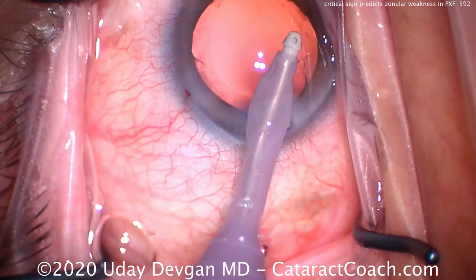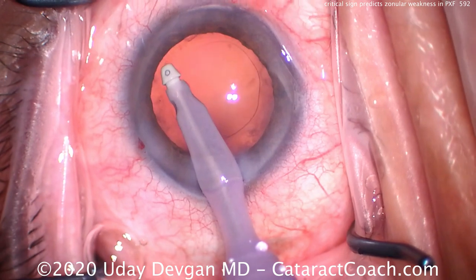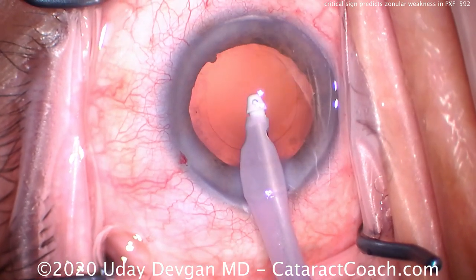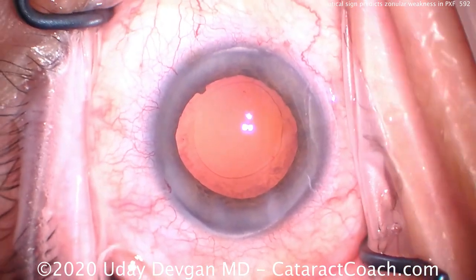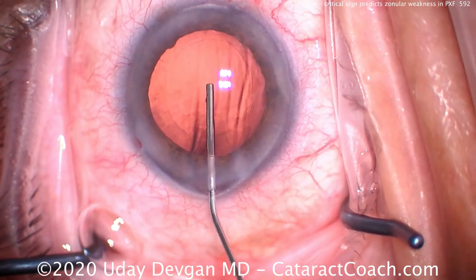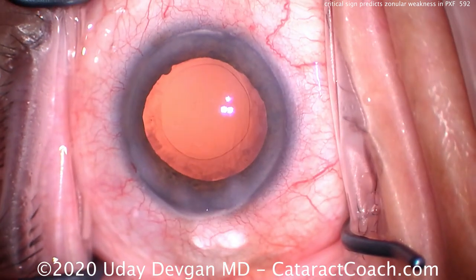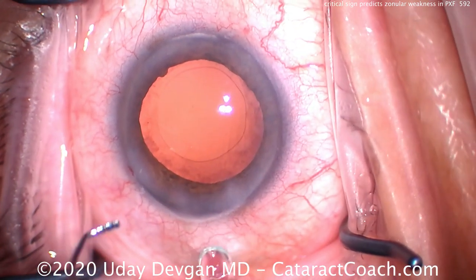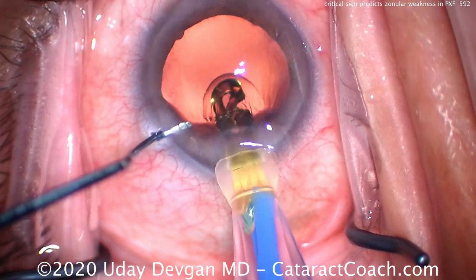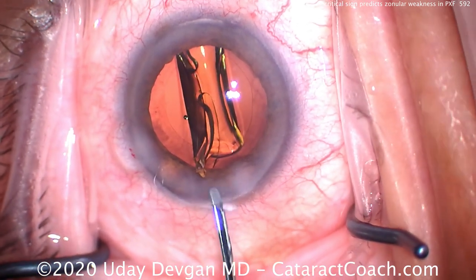When you operate, the first sign you'll notice of weak zonules is a deep anterior chamber — you put the viscoelastic in and you get a three or four millimeter deep anterior chamber, whereas the pre-op notes said it was 1.8 millimeters deep. The next sign is when you poke into the lens capsule to start the capsulorhexis, you'll have a tremendous amount of wrinkling of the anterior capsule, making it more difficult to do the rhexis. In those cases you need to be prepared for significant zonular weakness and possibly even the need for additional support to fixate the lens.